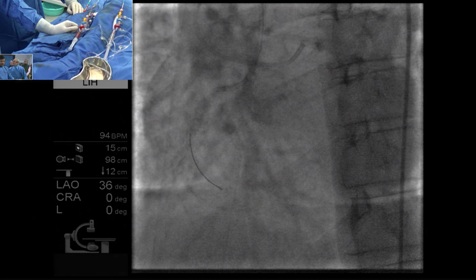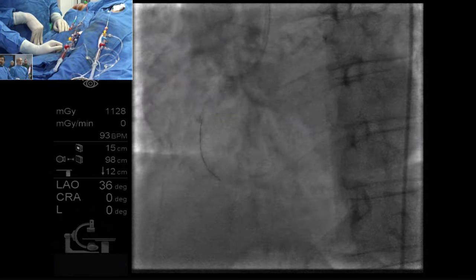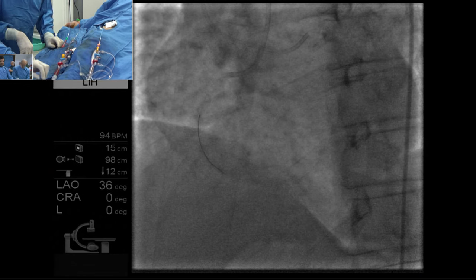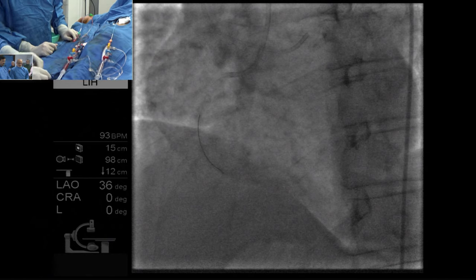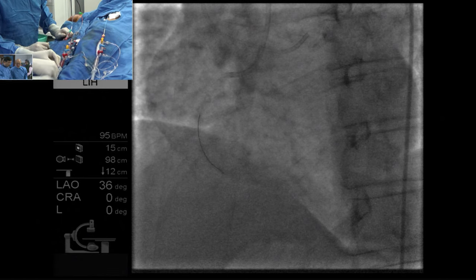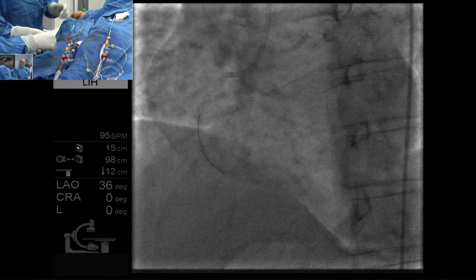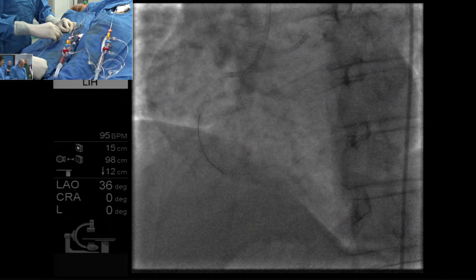Dr. Patel, New York. There is a double challenge. One is heavy calcification, another is CTO. My question to you: without crossing the distal cap, do you frequently predilate the proximal lesion? Sometimes. Not frequently, sometimes. Because there may be dissection, and if I lose the wire, then... But we have to take that chance. Otherwise, I don't think there is any other way. That's right.